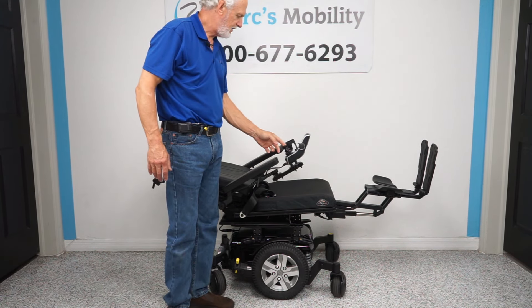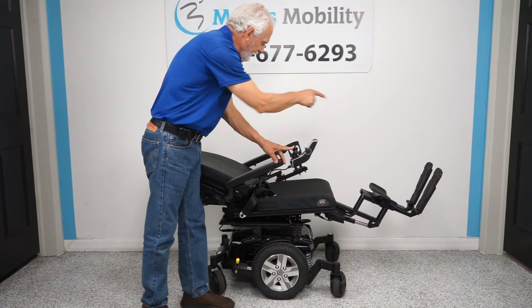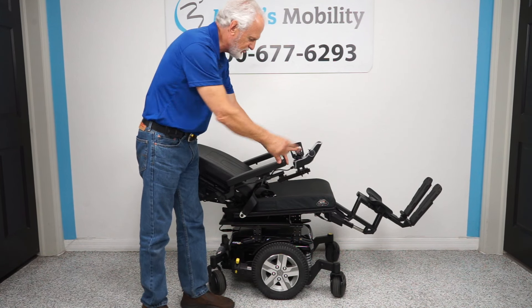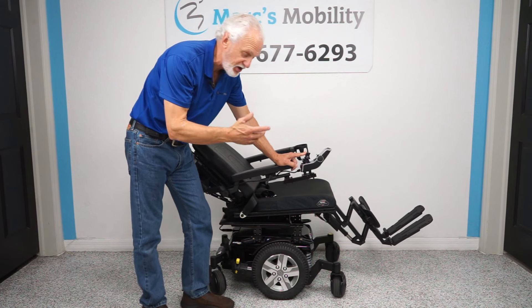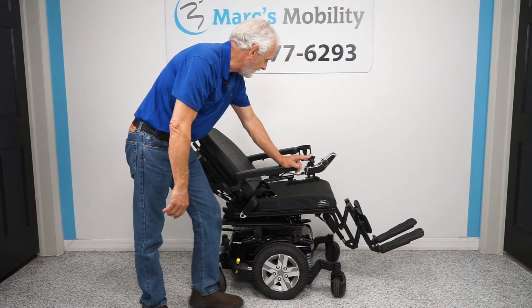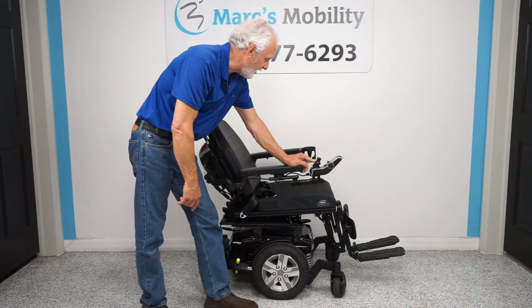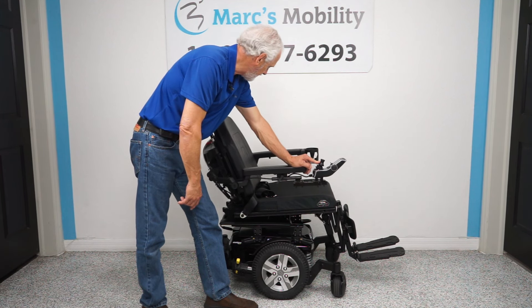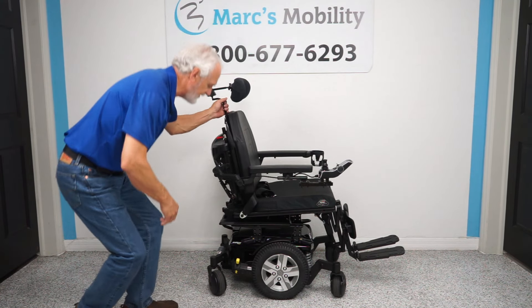I'm going to bring the back up and the legs down at the same time. With yellow back and yellow legs showing on the screen, I'm pushing the joystick forward — very simple. If you buy this chair, just go back to the video if you forget, because it's all there. Now I'll keep bringing the back forward until we're in the driving position.